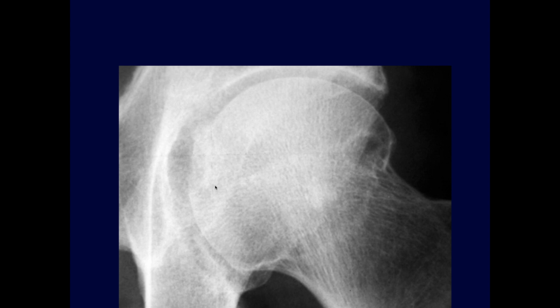Probably age dependent. So we just have a zoomed in radiograph of a left hip. First, I just looked at the acetabular coverage. I think it looks okay. I guess the circles are showing this kind of lucency at the superior femoral head neck junction, maybe a little bit of cystic change. So what would you call these?